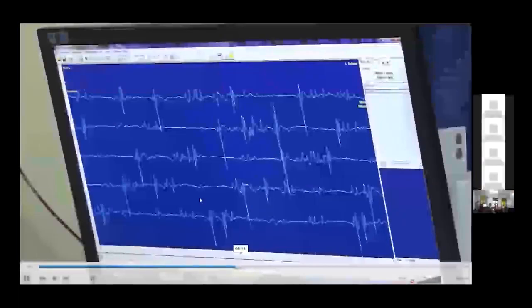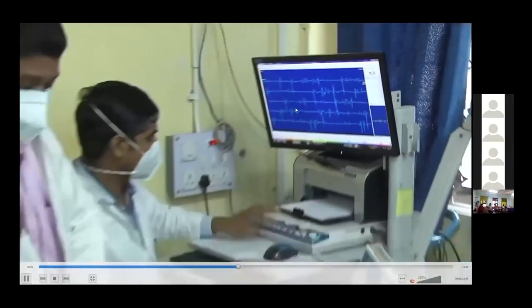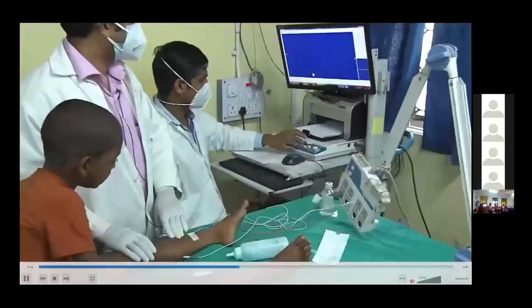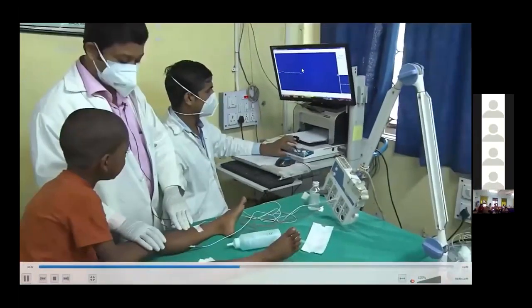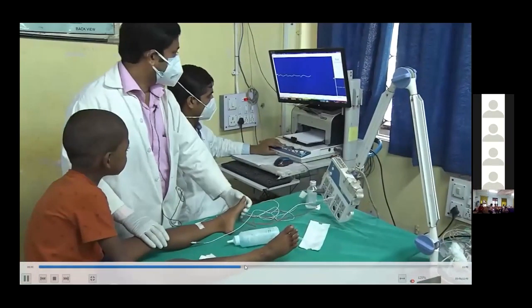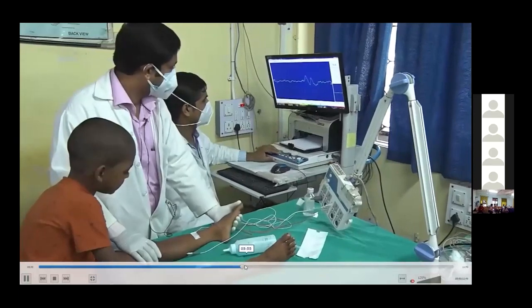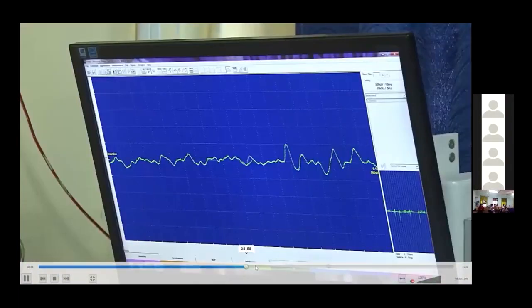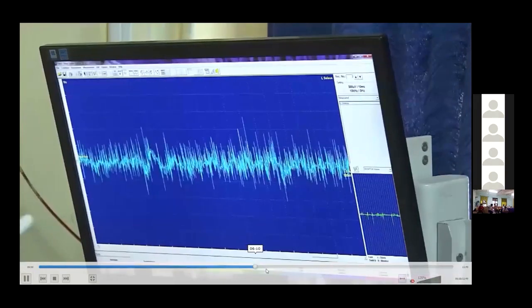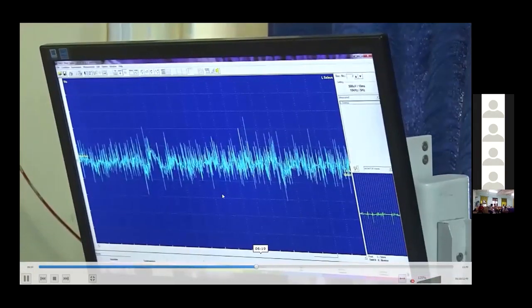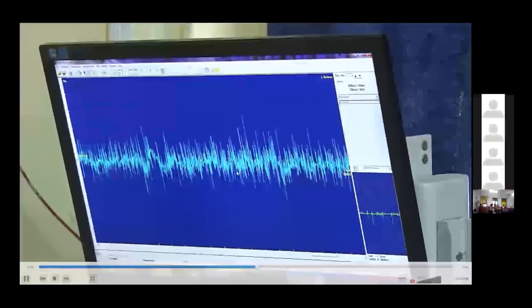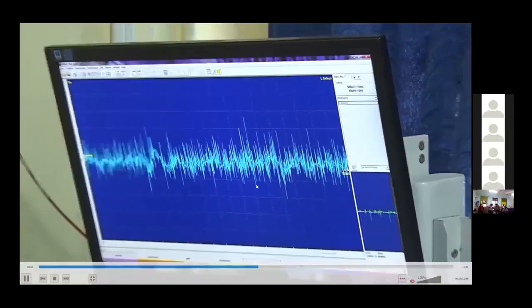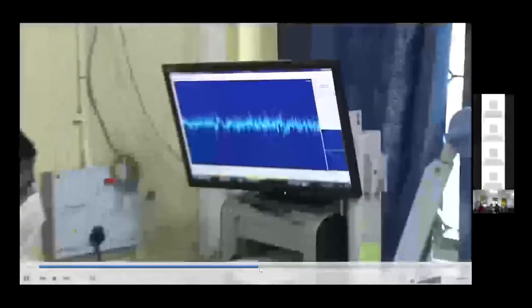Now we have to fix it and see the duration, the phases, the amplitude. And this is the interference pattern. Here we see the interference pattern is normal.